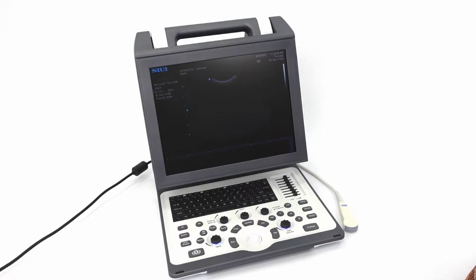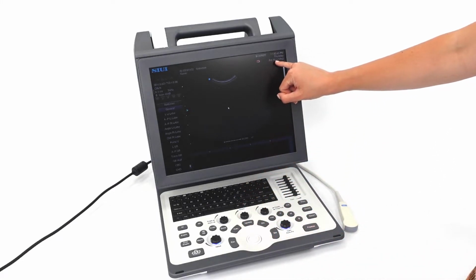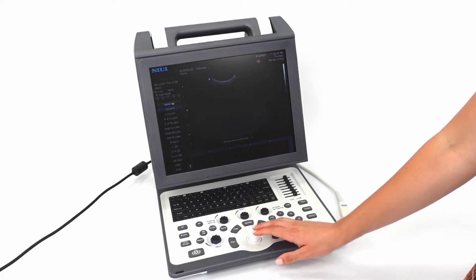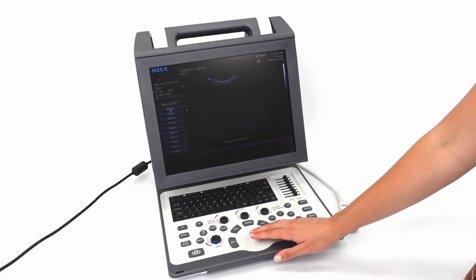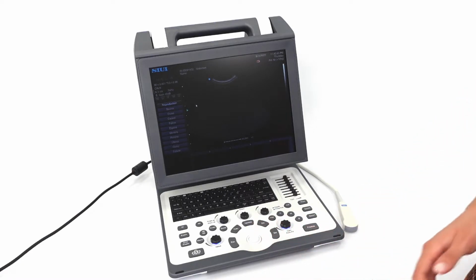To perform gestational age calculations on the Apogee 2300, you freeze your image while scanning and press Calc. If you're in the general pet abdomen mode, you'll have to navigate to find your reproductive calculation. So you would move your mouse over abdomen, press Set, and you can then find it there. You'll see you have a whole range of species you can access here. The easiest way if you're scanning dogs is to just remember before you start your exam.